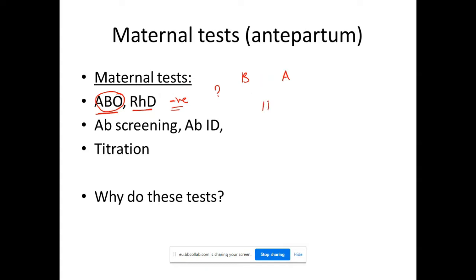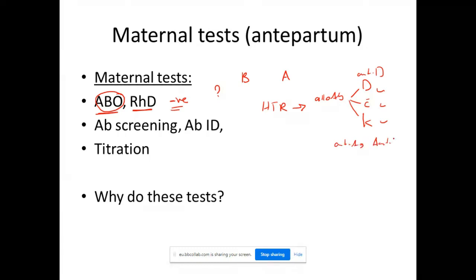So usually the severe hemolytic reaction results from the presence of a certain antibody, and usually the most common one is anti-D. However, it can be anti-small c, or anti-big K, and it may also happen as a result of different antibodies, but these are the most common. Among these antibodies, we don't see anti-A or anti-B. So what do you think? Why? The severe cases are usually related to these, which are the most common.